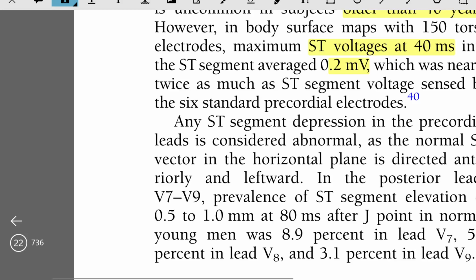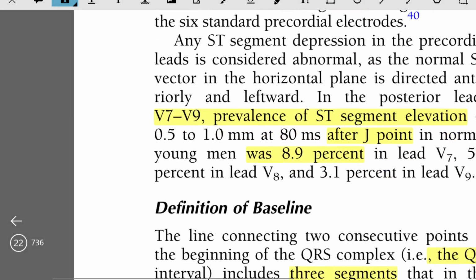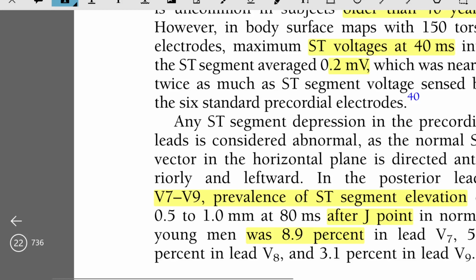In the posterior leads V7 to V9, prevalence of the ST segment elevation of 0.5 to 1 mm at 80 milliseconds after J point in normal young men was 8.9% in lead V7, 5.8% in lead V8, and 3.1% in lead V9.